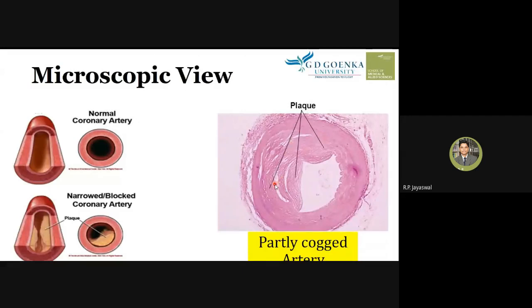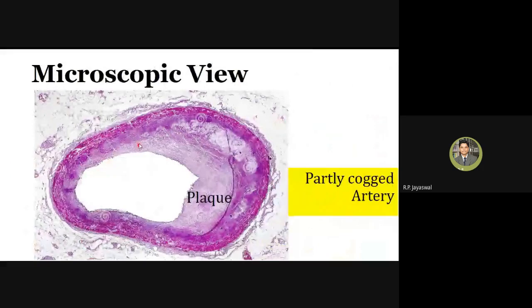And then the microscopic view of this coronary artery which has undergone partial plaque formation, where you can see the half of the coronary artery having the plaque.